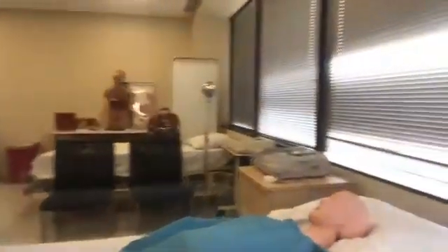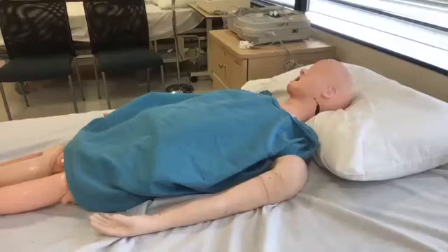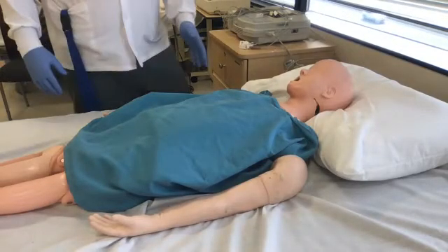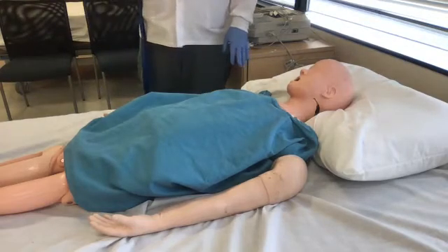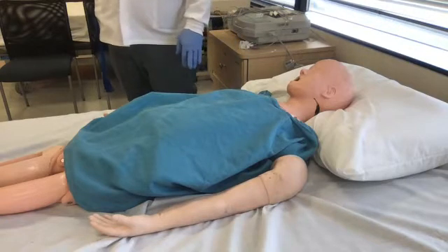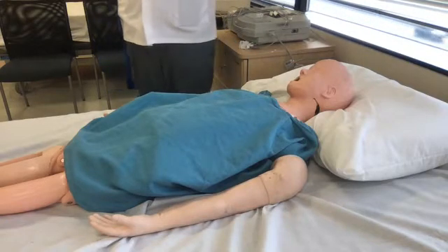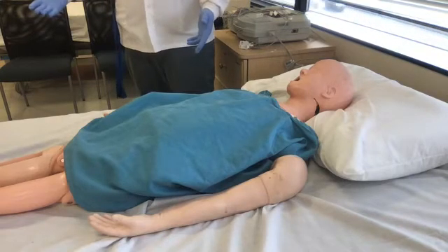Okay. So bringing back to what I was stating, EKG could be a screening and a definitive test. What is the first thing we have to do? I have to make sure I got orders, just like we were talking about earlier. I need an order. I can't just do this just because I feel like it.